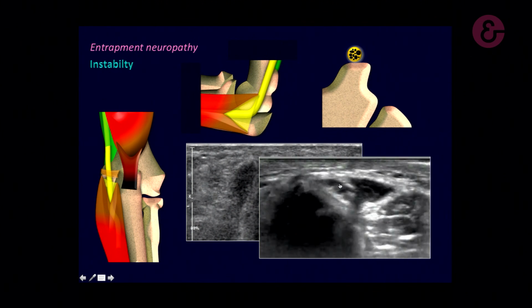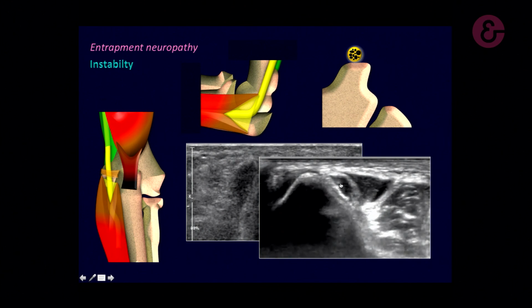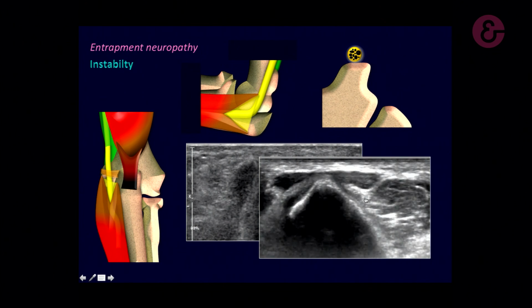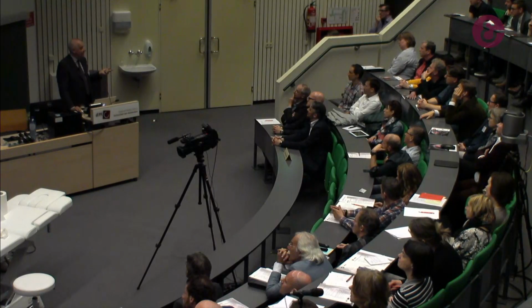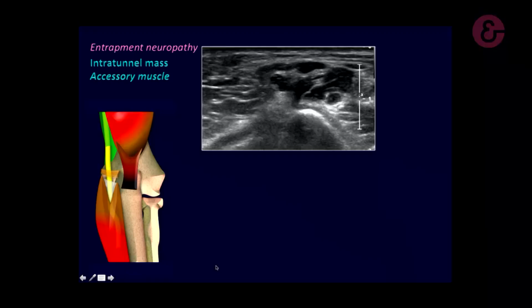First, the ulnar nerve, which is here. So during flexion, you can see the nerve going on the other side. Tuck first, and then this is the tendon of the triceps, which goes up on the other side. So the double click: first the nerve, and then the triceps, which is quite important because it's surgical. You can operate by removing a part of the triceps muscle usually. So you must know this in the report.